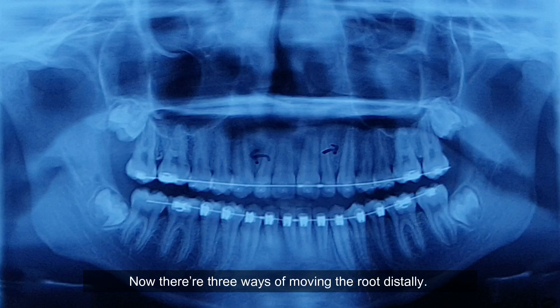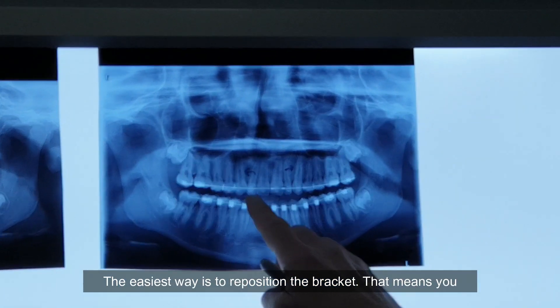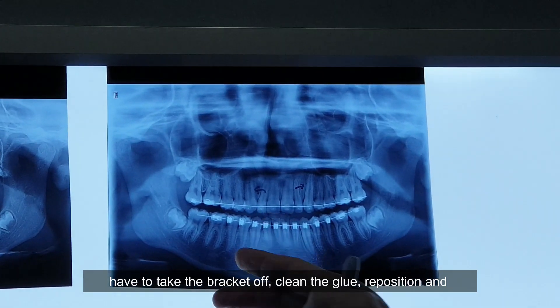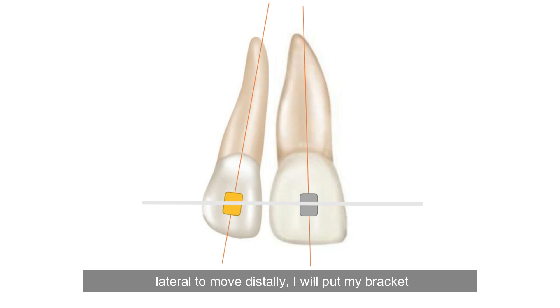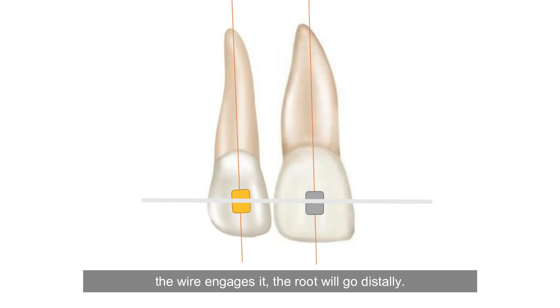Now there are three ways of moving the root distally. The easiest way is to reposition the bracket, but that means you have to take the bracket off, clean the glue, reposition, and step back to another wire. If I want the root of the lateral to move distally, I will put my bracket on tooth one-two more mesially. So my bracket points mesially, the wire engages it, and the root will go distally.